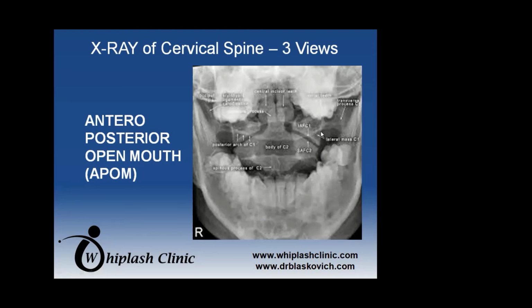And the relative space between the outside of the lateral mass to the jawline should be relatively equal on both sides. And in this case, I would say maybe this side is slightly bigger, but very minimal based on the other landmarks that I just explained. And this large white mass right here, these are the upper molars on this person's right. And this large white mass are their upper molars on their left.